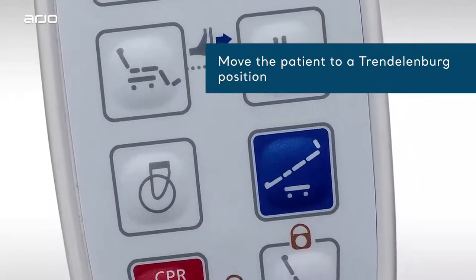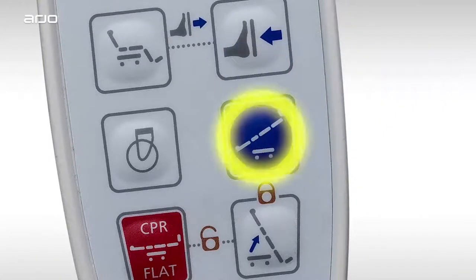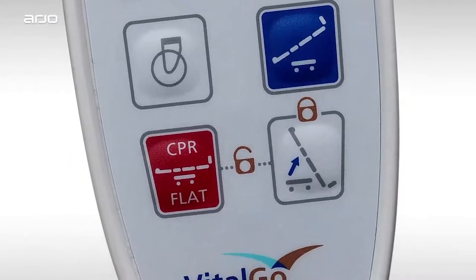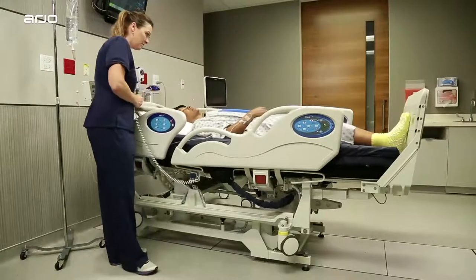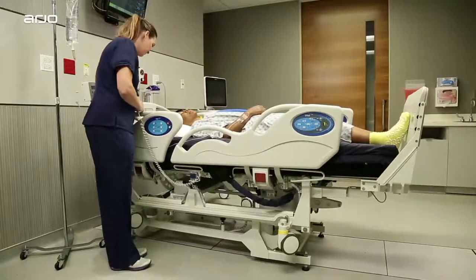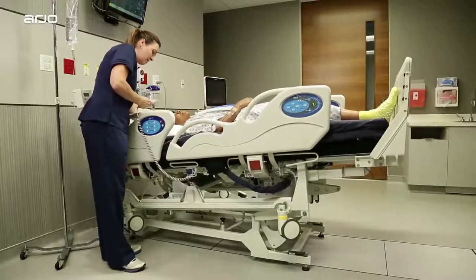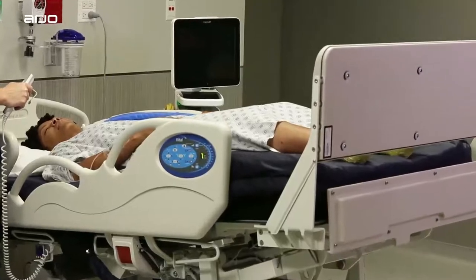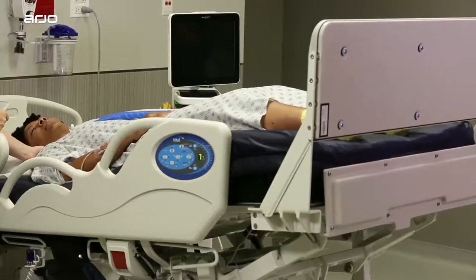To move the patient into the Trendelenburg position for selected care procedures, push the blue button on the hand pendant. If nothing happens, check that the bed is unlocked by pressing buttons 11 and 12 together until you hear two beeps. The bed will move into a horizontal position first, then into Trendelenburg. If a greater angle is needed while in the Trendelenburg position, press the legs up button to raise the legs further and increase the hemodynamic effects.